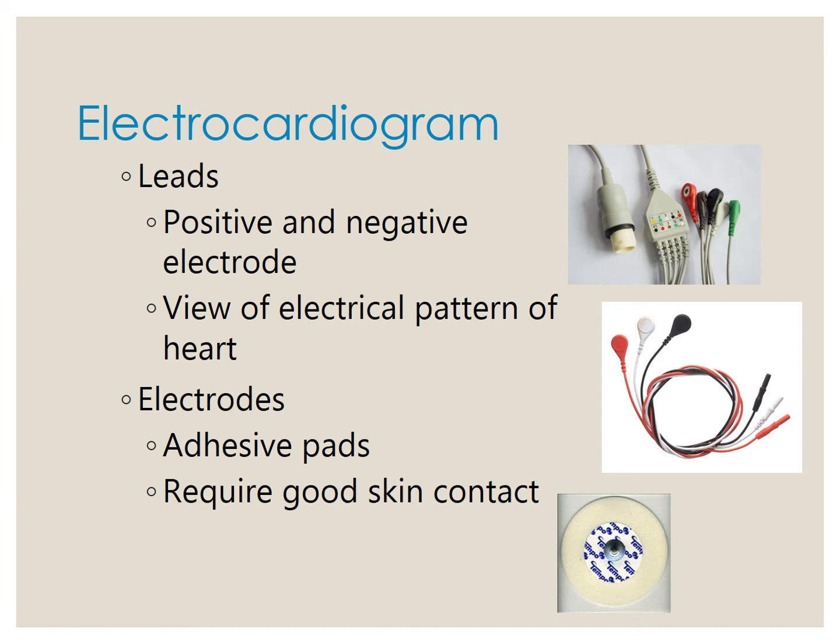If you have a male that has a very hairy chest, it's important that you take clippers and clip the area where you're going to put those stickers. Because if you put those stickers just on a bed of hair, you are not going to get good conduction through that. And again, we don't shave, right? Because if we shave, you may nick the skin, and we have other potential problems with that. So just remember, if they have a hairy chest, we need to clip the areas and then put the leads on. So take the time to do this.